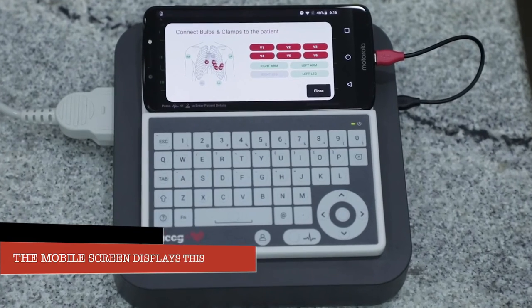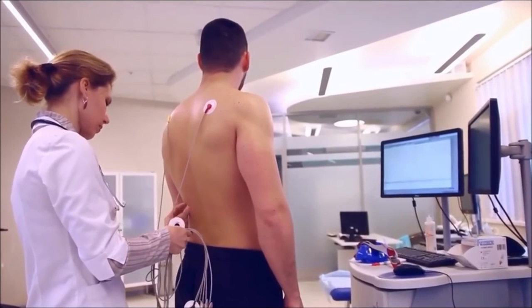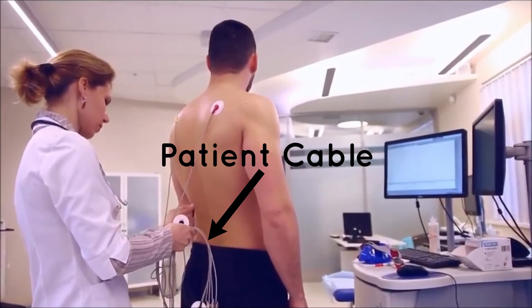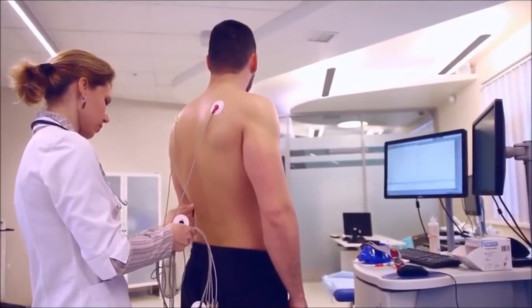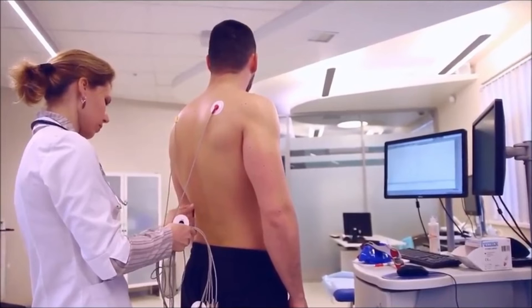The third component is the patient cable, also known as the ECG cable. It interfaces between the electrodes and the machine, carrying electrical impulses to the machine CPU board to analyze and display the ECG complex.